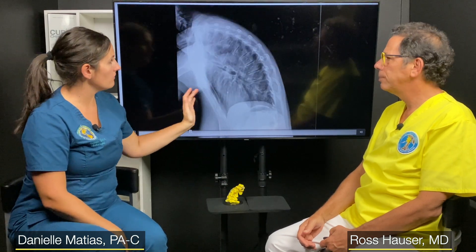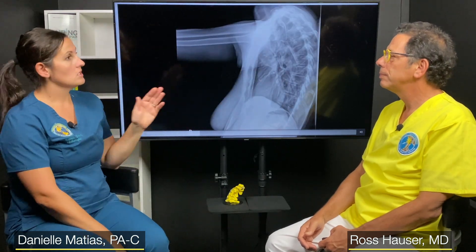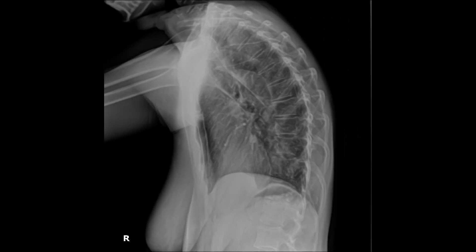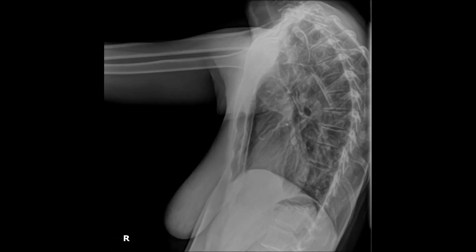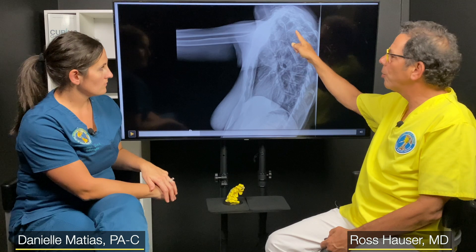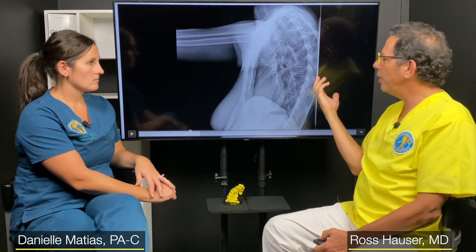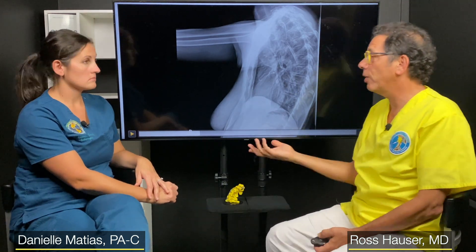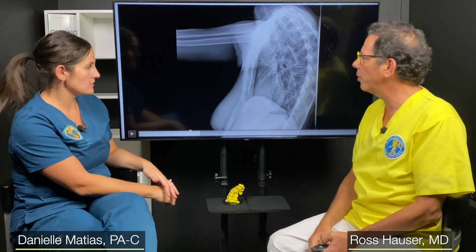Here's a motion x-ray of the thoracic spine — we can watch this person move, and this is almost the opposite of instability. It's really not even moving at all. Another example of 'to see is to know' — do you have instability or not, and how do we best treat the problem? Are the vertebrae aligned or not? If somebody has lack of motion, they're going to need physical therapy, mobilization exercises.